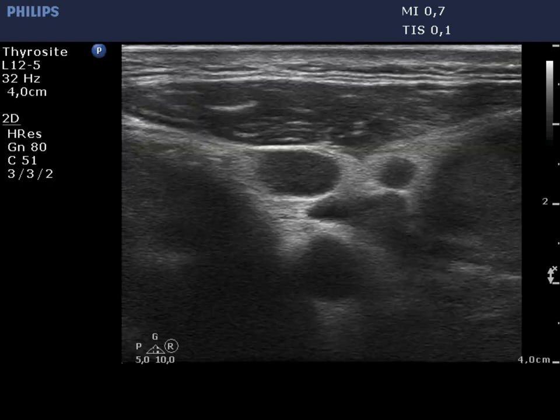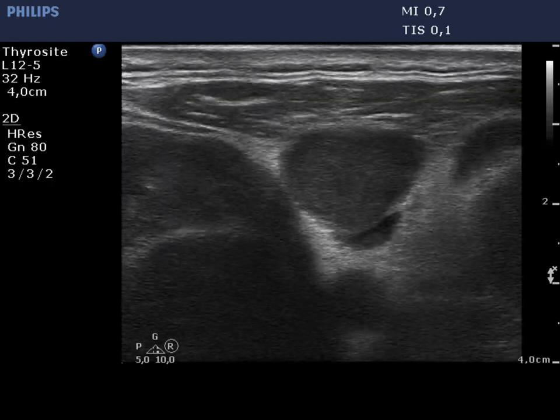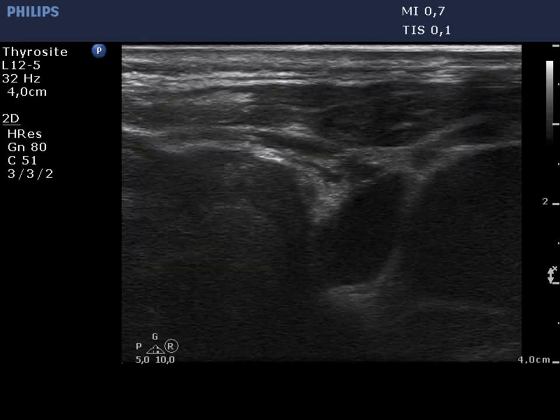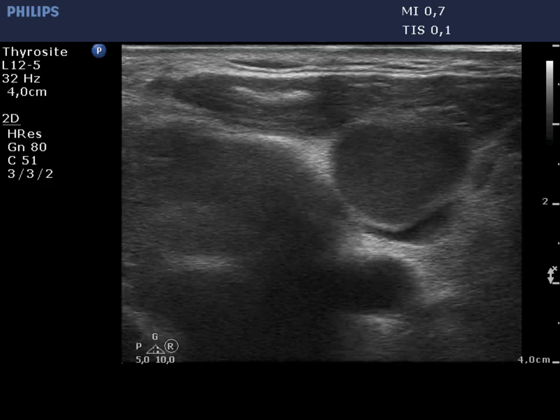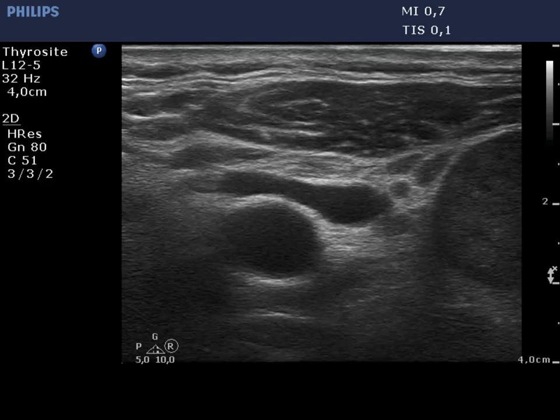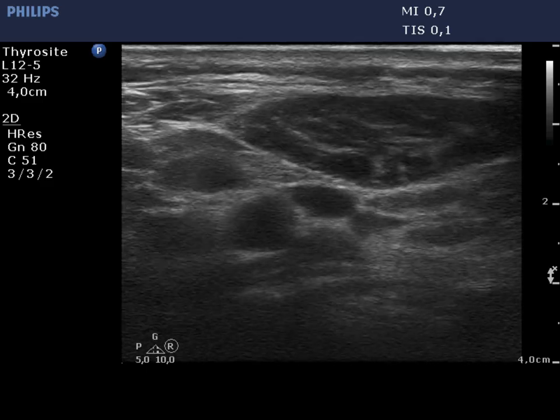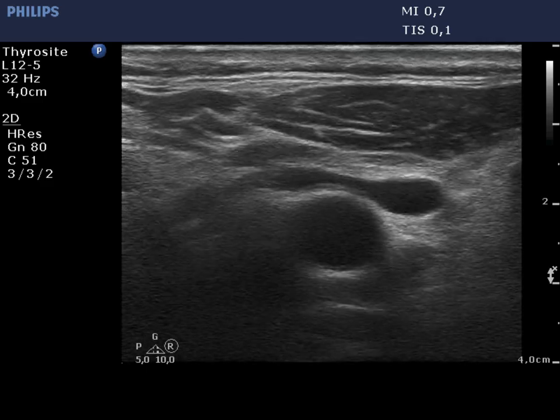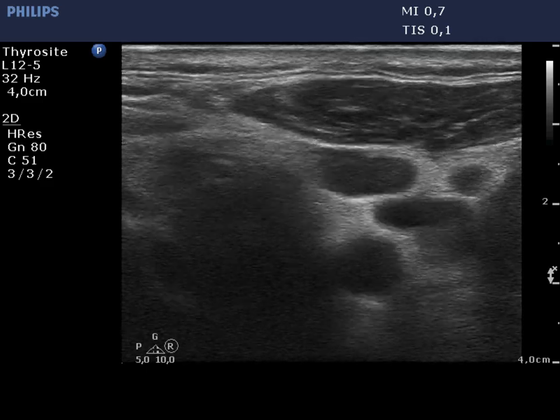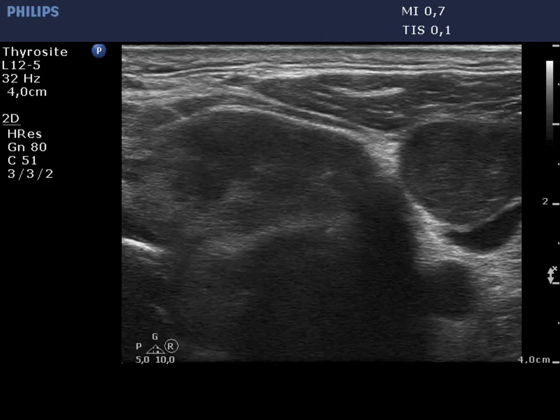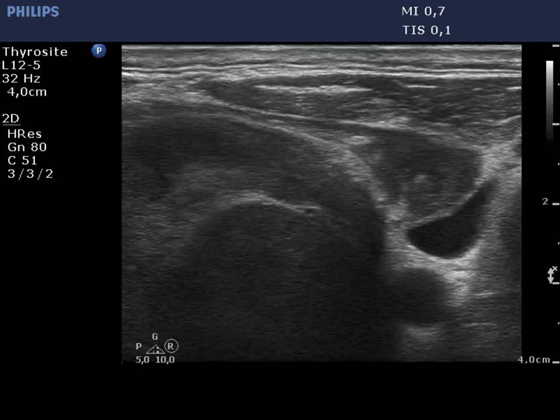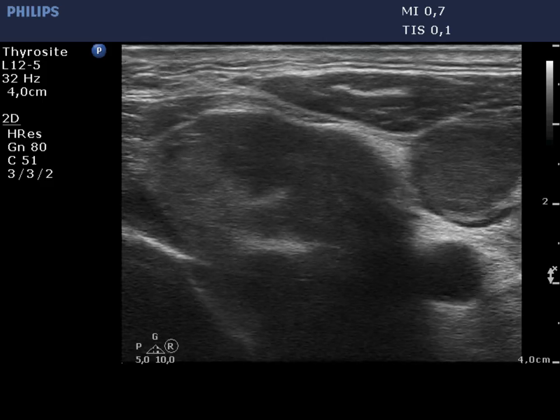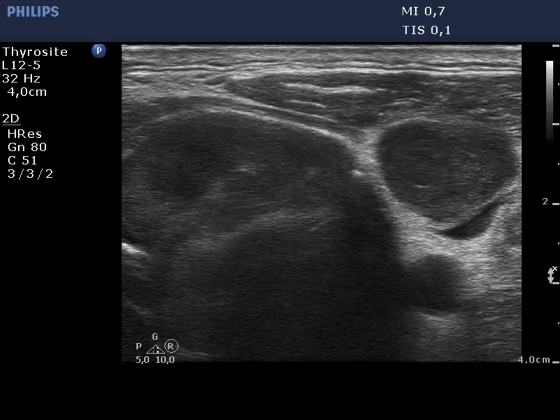There are multiple metastatic lymph nodes lateral to the left lobe. They do not present a regular hylum. A hypoechoic nodule occupies the region.